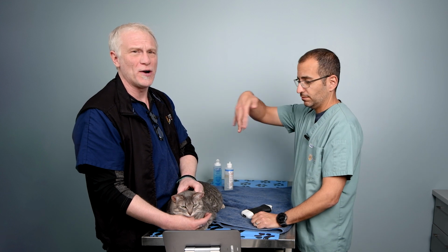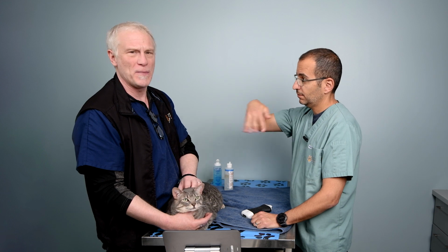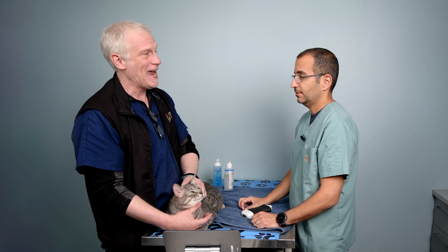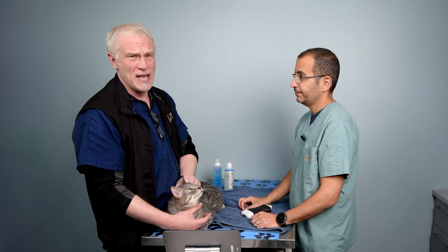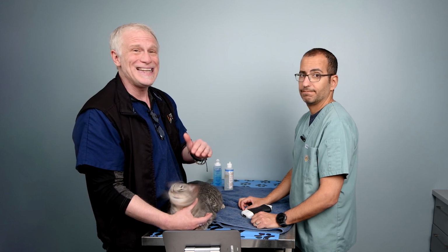So we are looking essentially for two different things. We're going to look for increased B lines, vertical white artifacts that extend to the far field, move back and forth from the lung surface with respirations. And we're going to look for lung consolidation. And what do those represent? Alveolar interstitial syndrome, like you mentioned, any decrease in aerated lung at the periphery. Anything that decreases that aeration of lung at the periphery of the lung will result in B lines and consolidation.